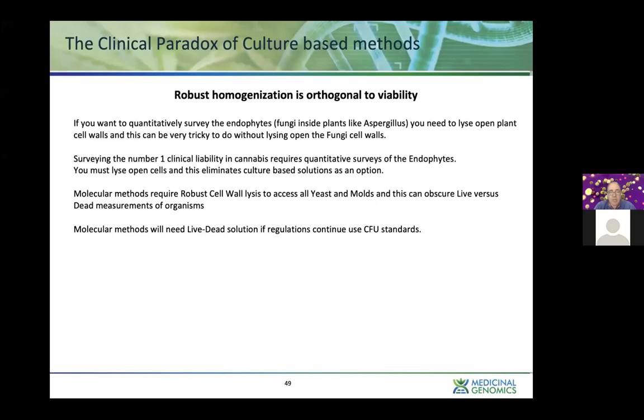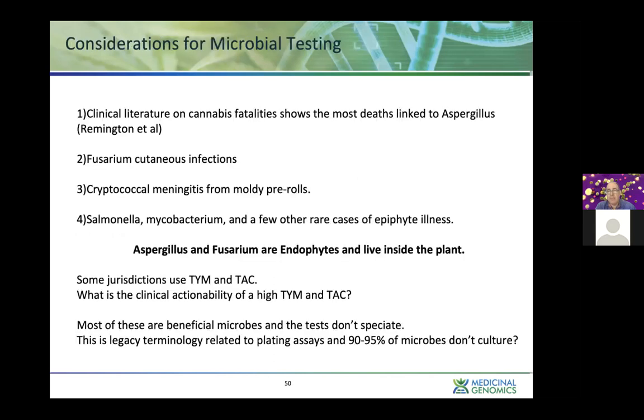Now, in doing so, you have to pay attention to live-dead, and that's probably a whole other webinar, how we deal with that, but live-dead can be tackled with PCR. That is another myth, that it can't handle that, but there are multiple techniques being utilized in the field to manage the live-dead situation, from centrifugation to enrichment to using nucleases, but it is doable.